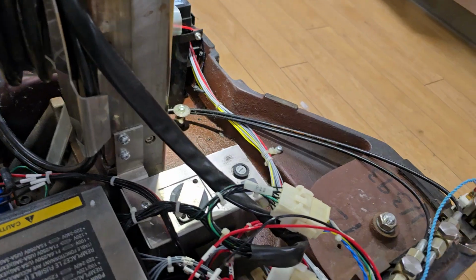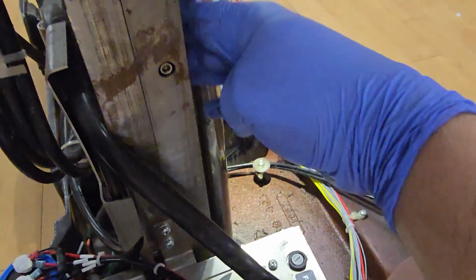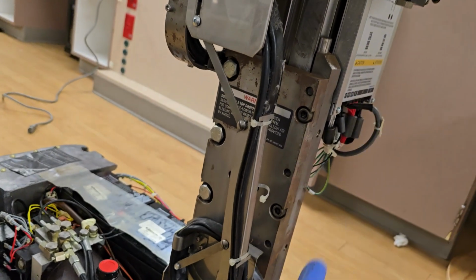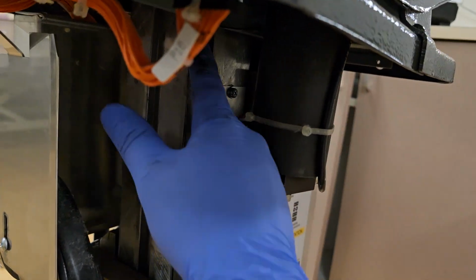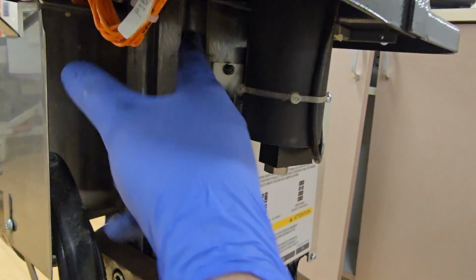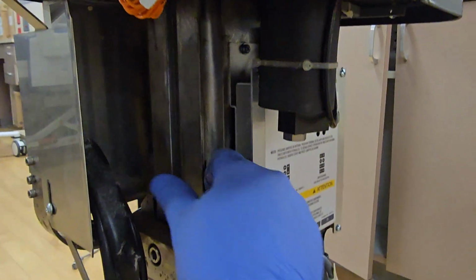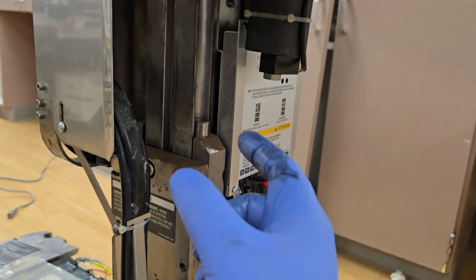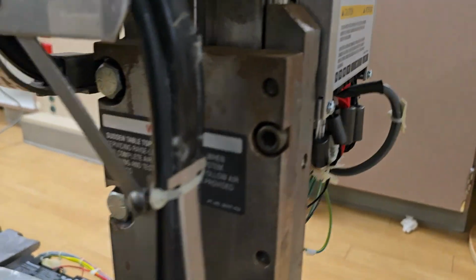So you want to get some moly grease, get in there, make sure that you got a coating on that rail. Next, when that rail's coated, you want to run this table up and down to make sure that you have grease on all your surfaces. See, now I got to make sure that there's a thin layer of grease up here too, because we want to adjust our lash of the linear ways. We want to adjust that lash with the grease, okay? Because the last thing you want to do is clamp down on something and have no grease on your bearing surface. That would be detrimental.